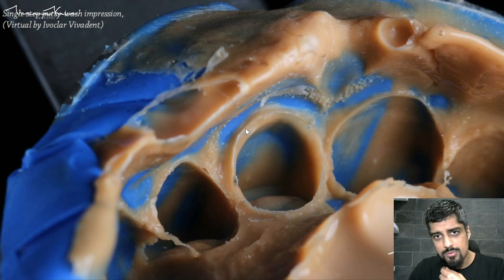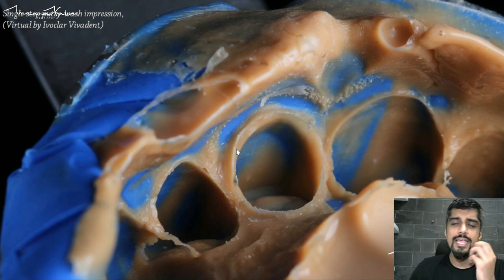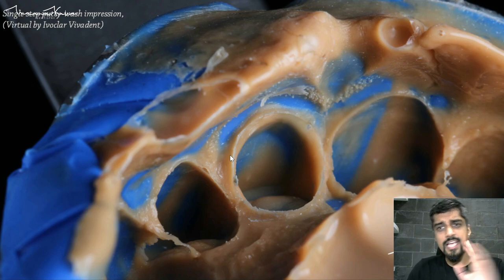This is the unprepared tooth structure — this little fin over here — and underneath that you have the thick margin that is visible, clearly recorded in the light body. Also notice that even the stippling has been picked up by the light body. This is showing you how much moisture control I achieved during the impression procedure.